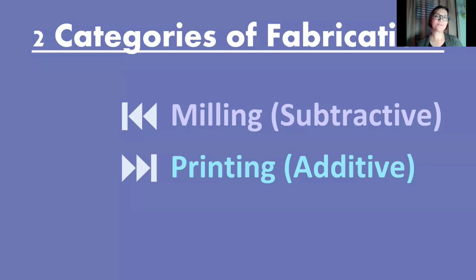And if you think about way back in first year dental school, when you learned how to do your composite, we would layer the resin, we do a layer and cure it, we do a layer and cure it, we do a layer and cure it until we created our tiny class 1 restoration. That is essentially what the printer is doing, but in much finer layers. And you can go down to 10 microns, 50 microns, whatever you put the settings at. And so you're creating these very small micron layers, and each one gets cured and builds up whatever you have designed.